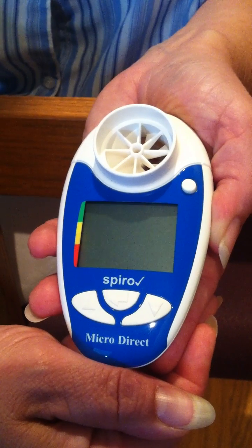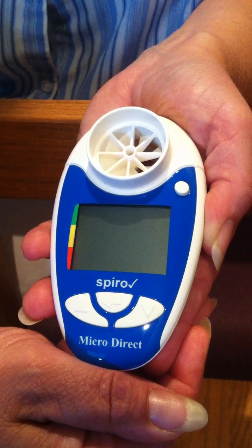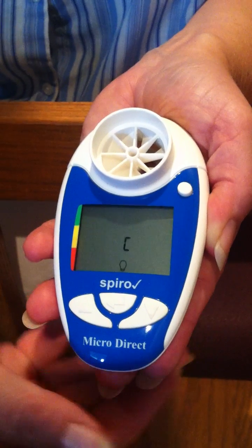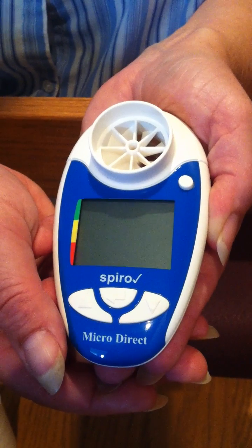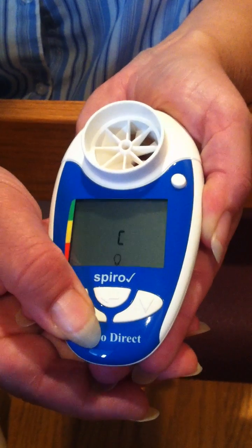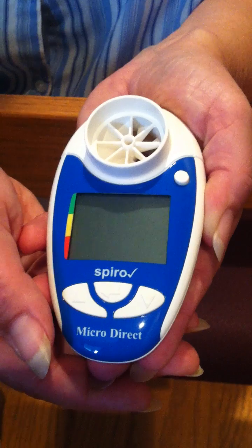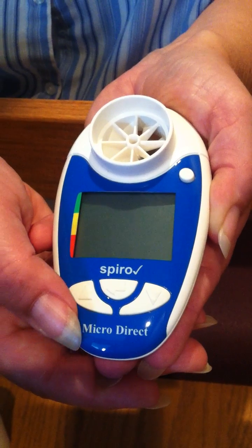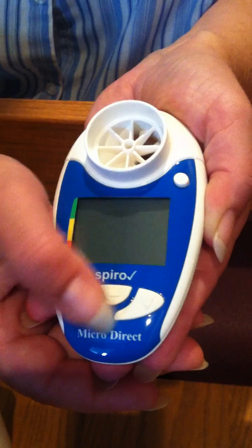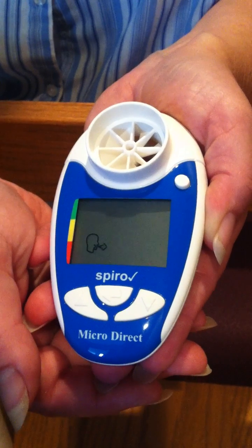Finally, select the person's ethnic origin by pressing the up or down arrow key and when the correct ethnic origin is displayed, press the enter button. C is for Caucasian, AA is for African American, and HA is for Hispanic. Please note you should enter a person of Asian descent as a Caucasian.